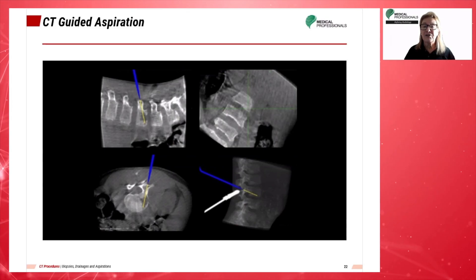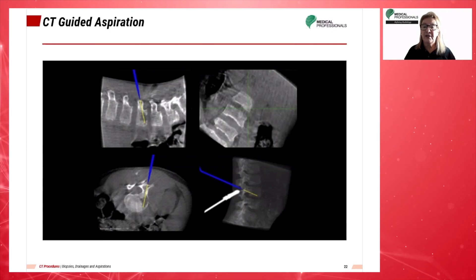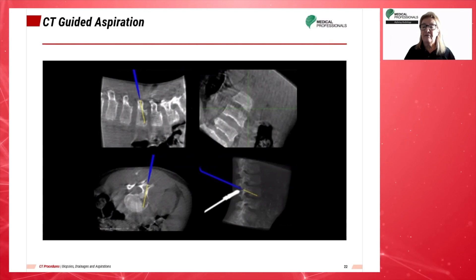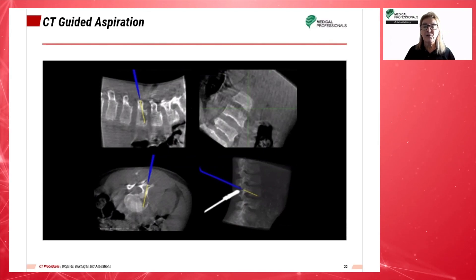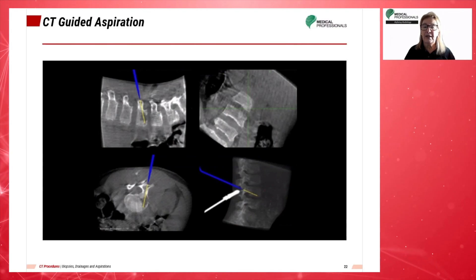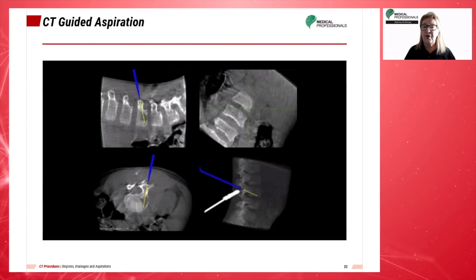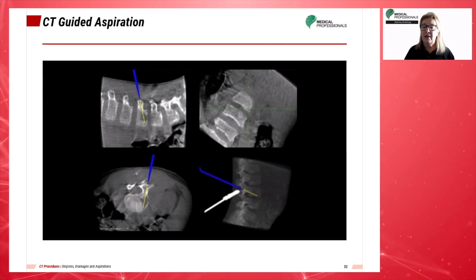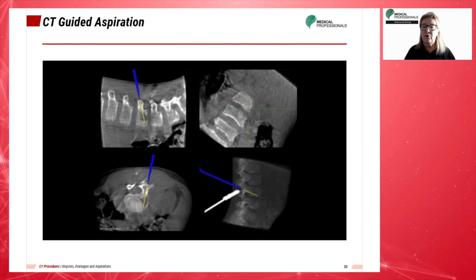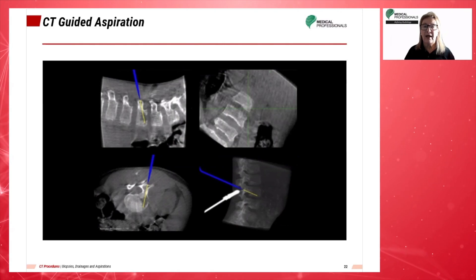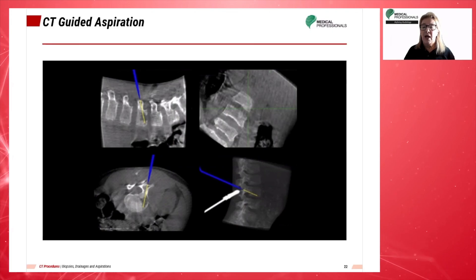Vertebral osteomyelitis rapidly progressed into the vertebral body of L4 as well as the L3-L4 disc. Though not common, the most common pathway of vertebral osteomyelitis is the result of hematogenous seeding.